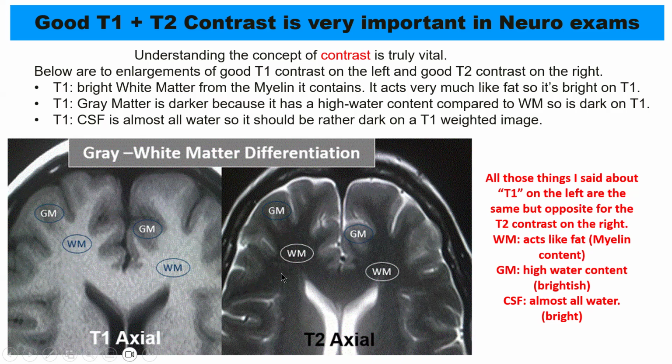So white matter here in the brain is dark because you knocked it into the transverse plane, but you waited a long TE and white matter got out of Dodge. It started going back to B0. There's not much of it in the transverse plane at TE, so it's dark.